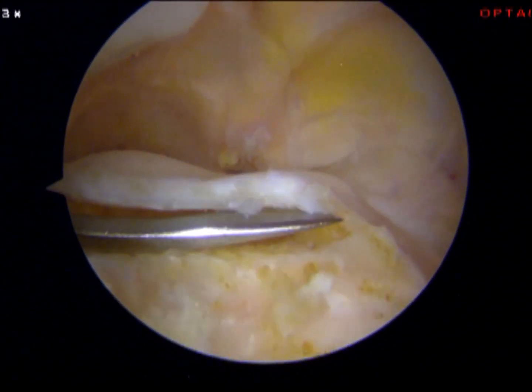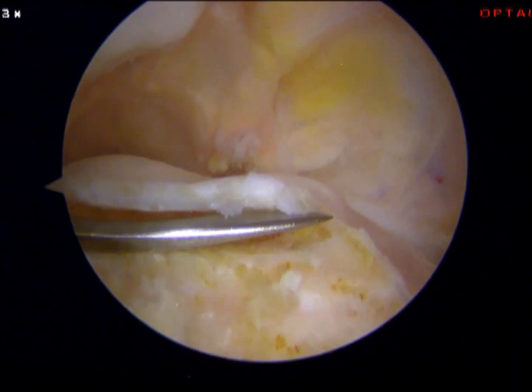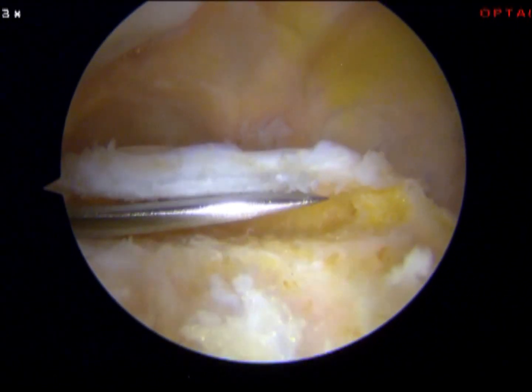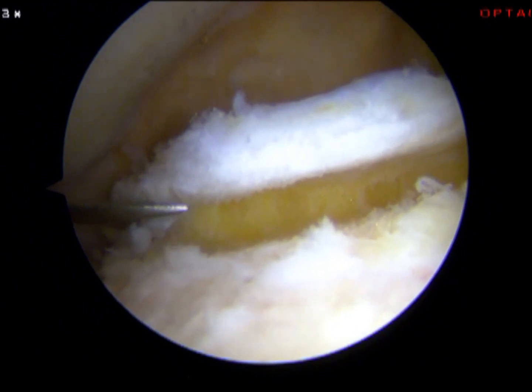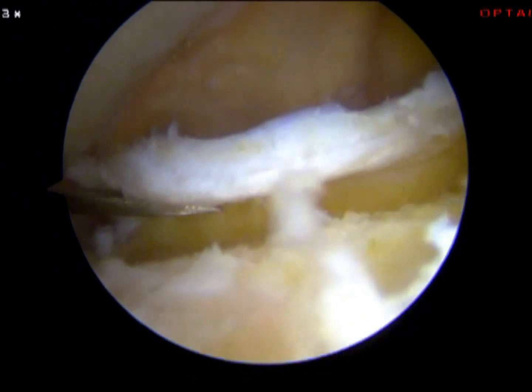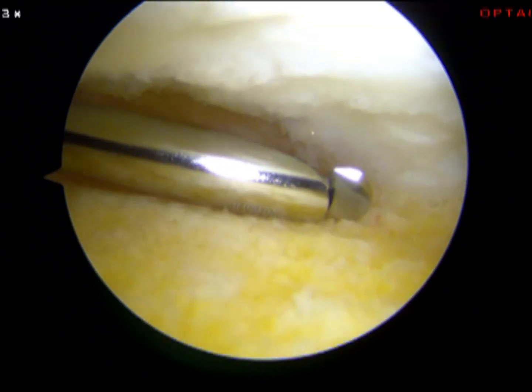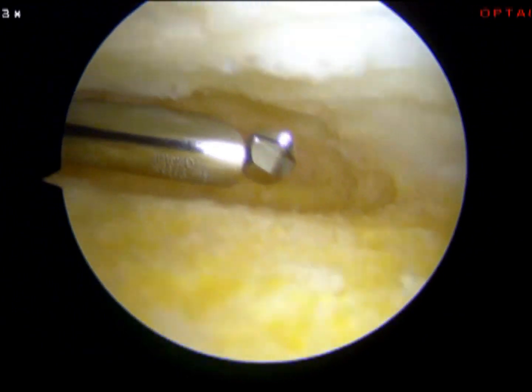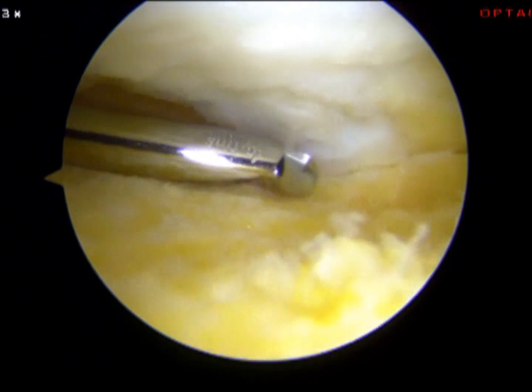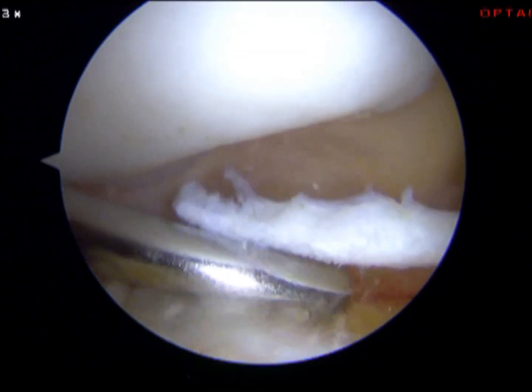I also use a chisel. This makes things a little easier and goes a little faster. I have to say, this is a quite time-consuming procedure. You need to be very careful not to harm the cartilage flake, so you have to be precise. And then you see here now, I have reached the area where the knee bends, and I'm not able to go further down.